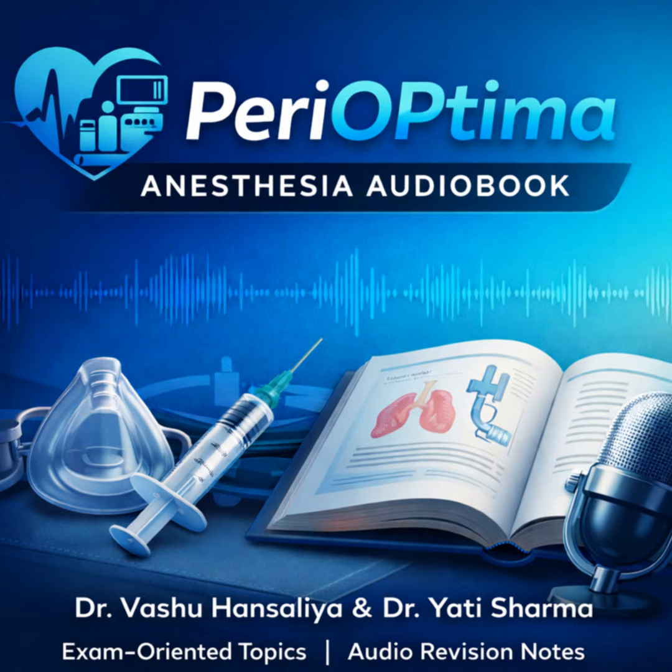Okay, now for the critical exam distinction. This is where we can earn the maximum points. We need to clearly define what these systems do protect against, and more importantly, what they absolutely do not protect against. This separation is absolutely vital for a comprehensive answer. They do protect against failures related to a pressure drop. Such as? Loss of pipeline pressure, low cylinder pressure because the tank is running out, or a major leak somewhere proximal to the flowmeters. The system reacts perfectly to a loss of mechanical energy in the O2 line.